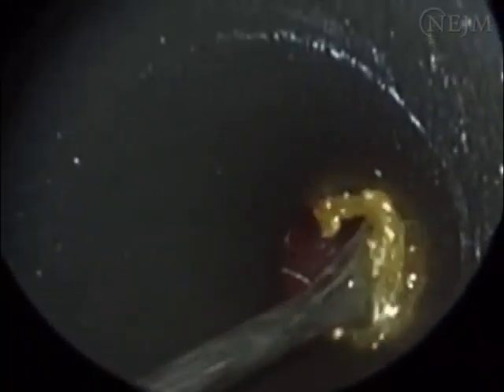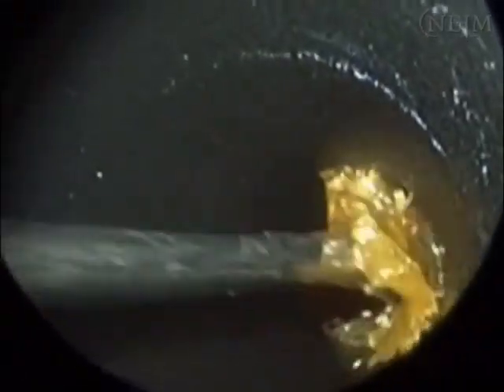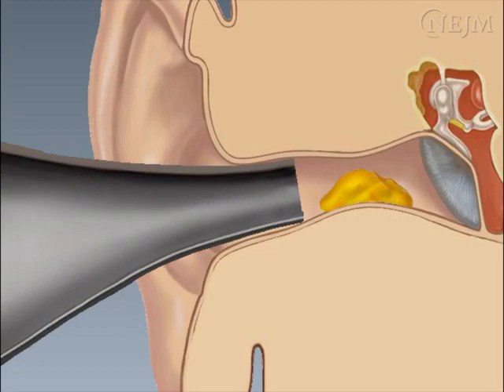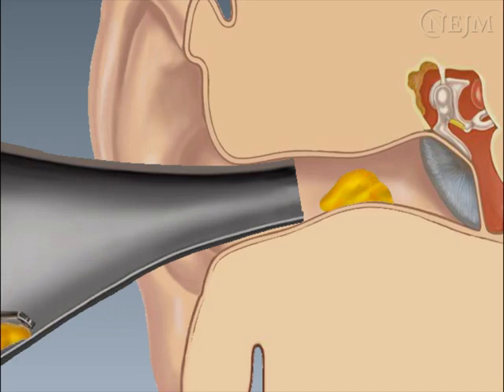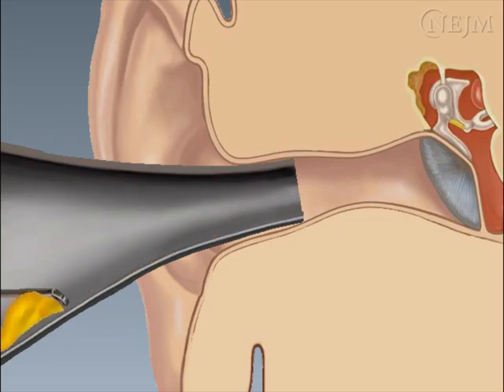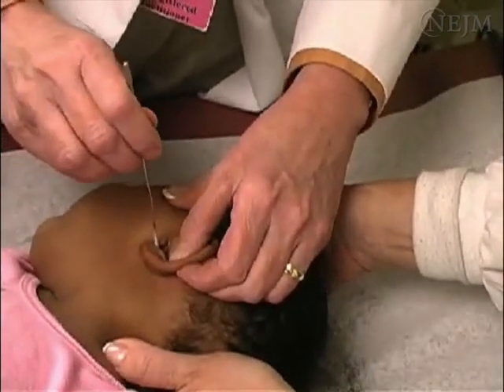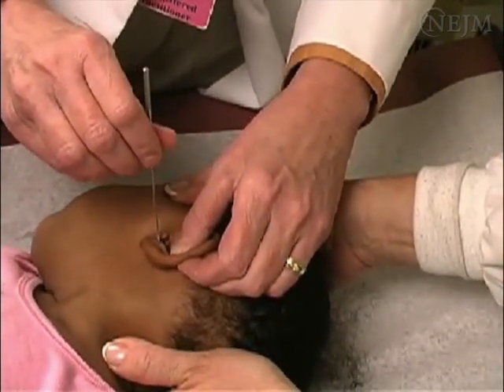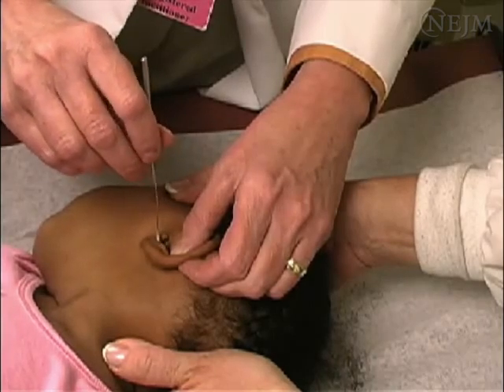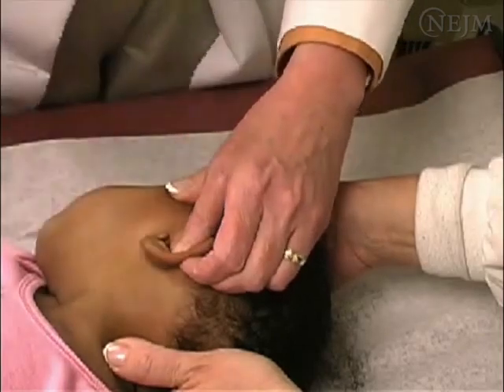Under direct visualization, advance the loop of the curette behind the piece of cerumen. Do not attempt to break through the cerumen, as this may result in further impaction. Rather, try to pass the loop of the curette behind the piece of cerumen, being careful not to traumatize the walls of the external auditory canal or the tympanic membrane with the curette. If small amounts of cerumen still remain, insert the triangular applicator wrapped in cotton approximately 0.5 cm in the canal, then twist the applicator while withdrawing it from the canal.